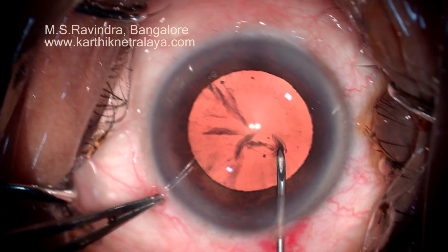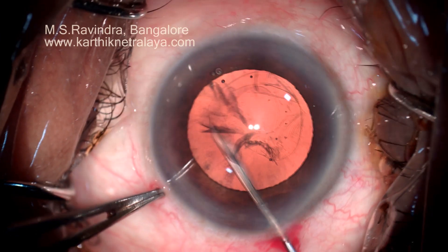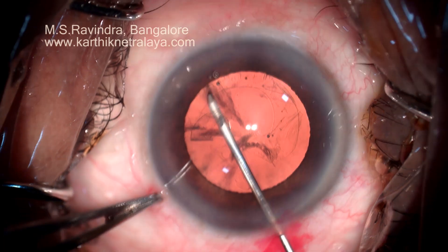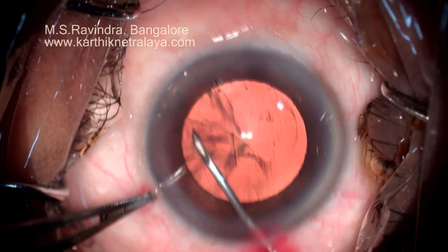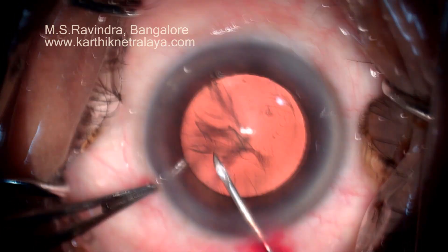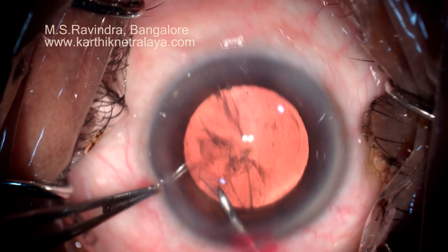HPMC fills the chamber. Capsulorhexis is performed and it's pretty controlled because there is no leakage of viscoelastic from the anterior chamber which shallows the chamber. The capsulorhexis is made parallel to the pupillary margin.